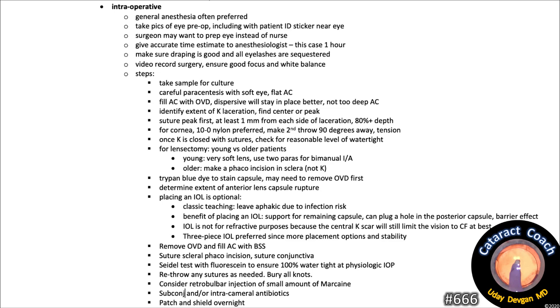Once the cornea is closed with sutures, check for reasonable water tightness. For the lensectomy, a young patient has a soft lens — you can use two paracenteses and do a bimanual IA. In older patients you may need to make a phaco incision; make it in the sclera as a sclerotunnel — do not make further incisions in the cornea. Trypan blue dye will help stain the capsule; you may need to evacuate the viscoelastic first to help the dye stick. Determine the extent of the anterior lens capsule rupture. Placing an IOL is optional — classic teaching is to leave the eye aphakic due to infection risk, but modern thinking supports placing an IOL for capsule support, to plug a hole in the posterior capsule, and as a barrier to keep vitreous back. The IOL is not for refractive purposes, since the central corneal scar will limit vision to count fingers at best. A three-piece IOL is preferred for more placement options and stability.